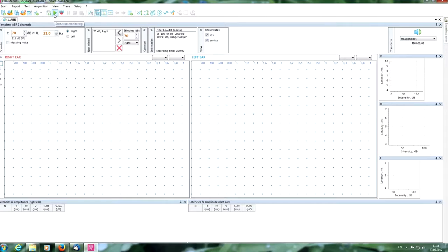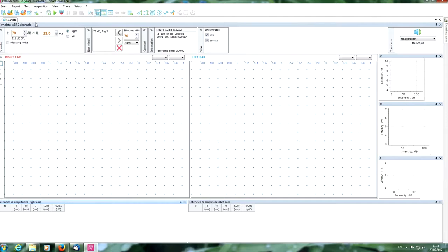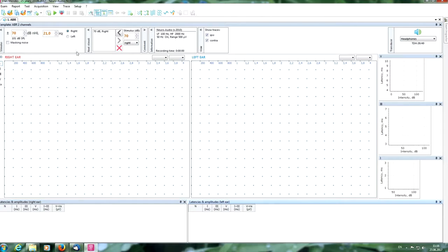Now check the signal quality by pressing the monitoring button. It is good, in the green borders, as you can see. Here we can see some parameters of stimulation. All the necessary settings you can see here. Also you can change them: stimulation rate, analysis, hardware settings, filters, sampling rate, stimulus parameters. You can choose from the big list, for example chirp stimulus, tone burst stimulus. Today we will use click stimulus. Now we choose the side of stimulation and start the acquisition.